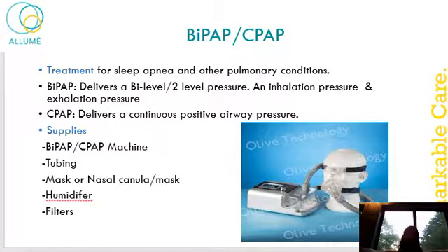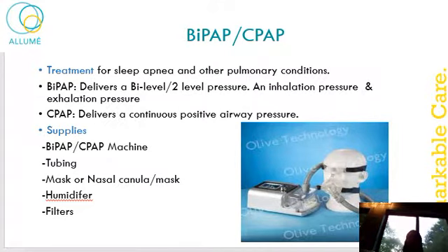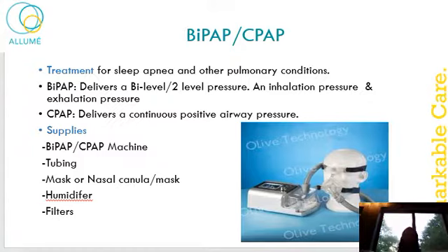The other thing I wanted to say about BiPAP and CPAP is that you have to also make sure that the settings are correct for your patient, and that the mask is cleaned very, very well. Every time you take it off, it needs to be sterilized. Check your orders for how you're supposed to clean the mask. If it's not cleaned, your patient can get some upper respiratory infections or fungal infections in their mouth or nose. So it's super important that we make sure that we're doing everything we can to keep our patients safe.